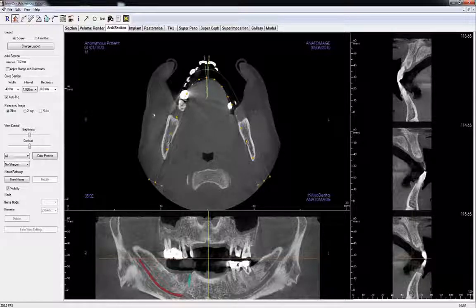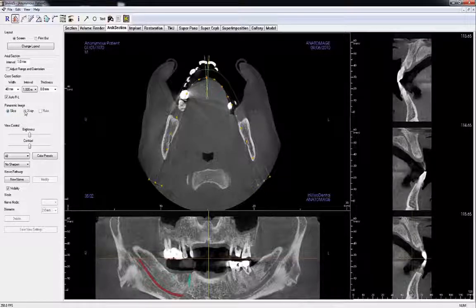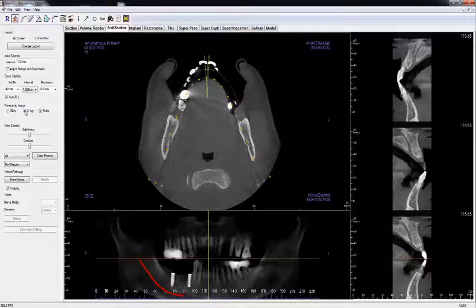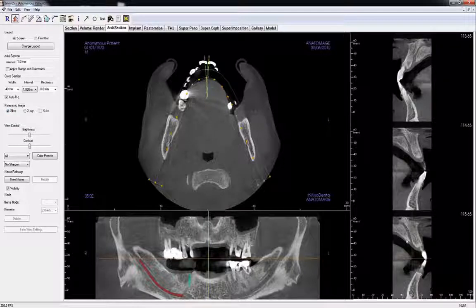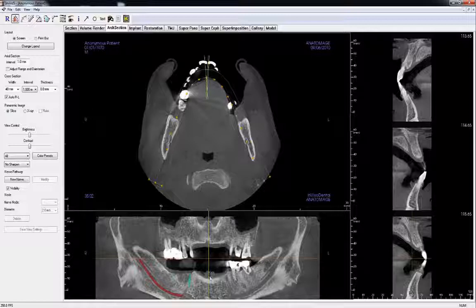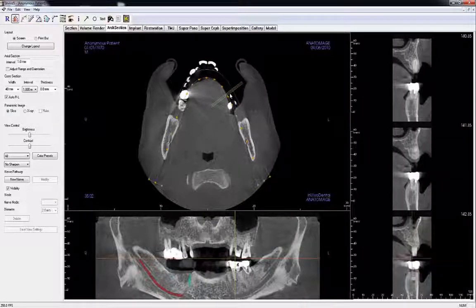Here is the axial view of the scan. The section below is the pano. This pano is currently in slice mode and may look different than the typical x-ray pano that you are more familiar with. In order to trace the nerve, the pano will need to be in slice mode to be 3D. On the right are cross-sections that correspond to the three green lines in the axial view and the green line in the pano view. As I move the green lines, the cross-sections will update according to where I am along the arch spline.